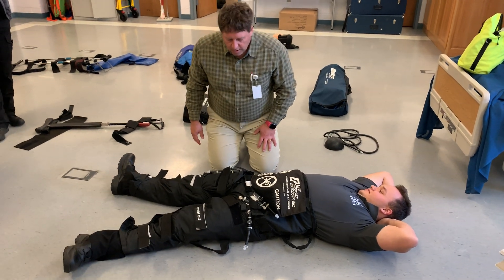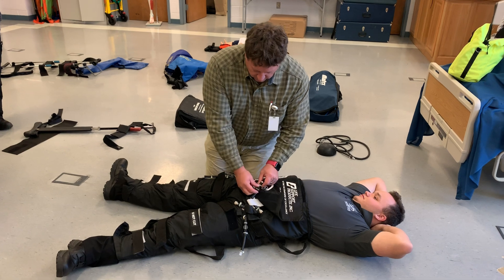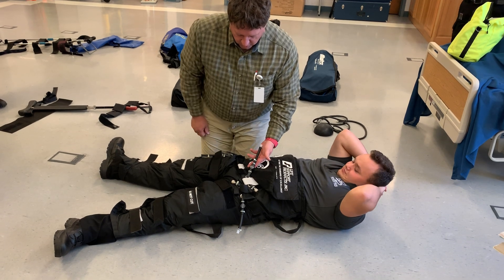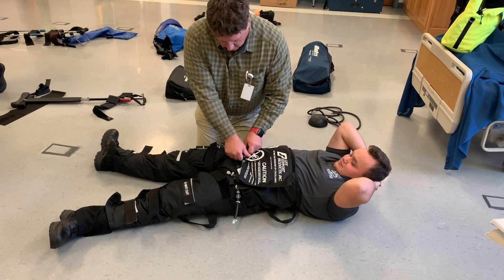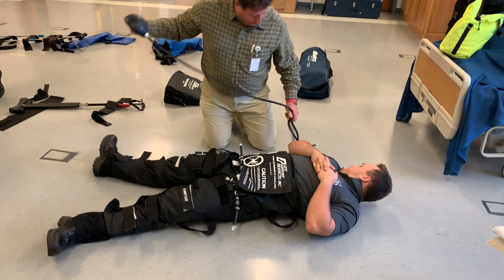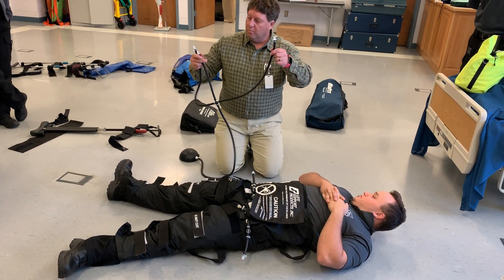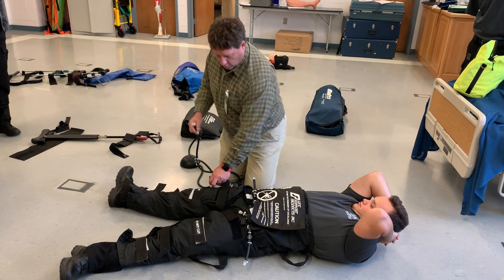Now if you look at the tubes, there are three tubes, and each one has a knob that can be turned. When the white line is in line with the tube, it's open; when it's perpendicular, it's closed — just like most other gauges. I'm going to open them all up. The foot pump usually has one long tube and two shorter ones: the long one goes to the belly, and the shorter ones go to the legs. It really doesn't matter which, and I'll put one into each.